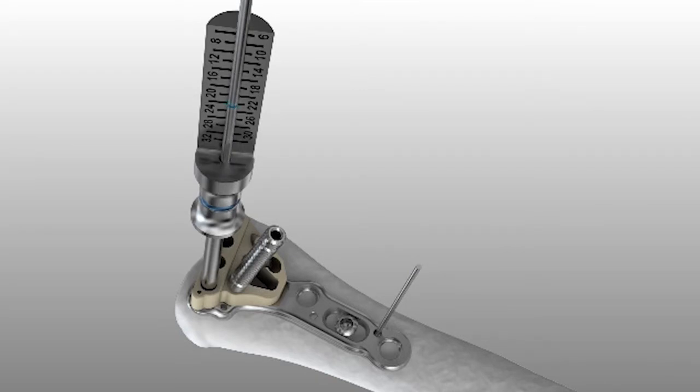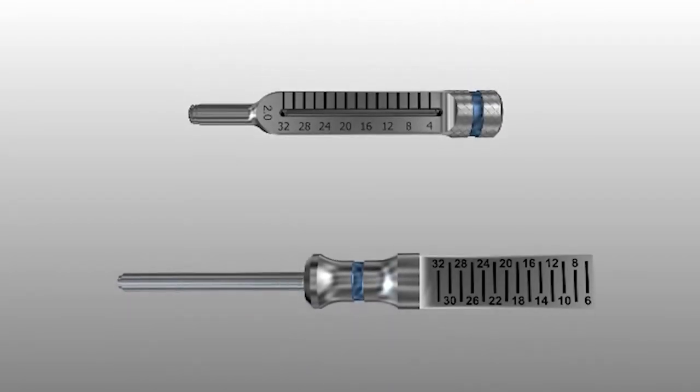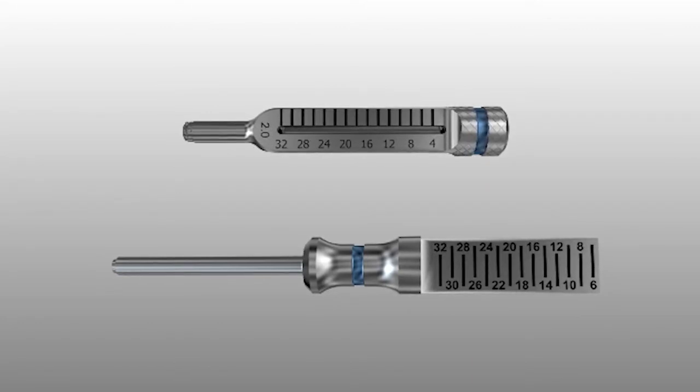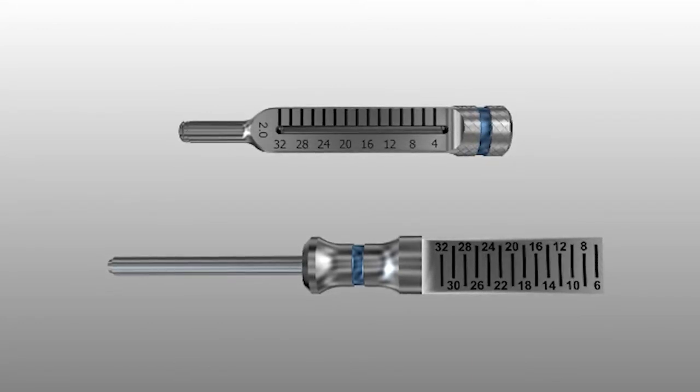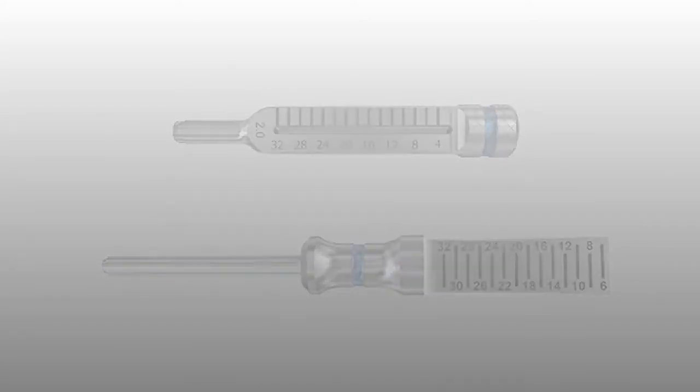Screw length is measured by using the laser mark on the drill or depth probe against the scale on the drill guide. Individual locking drill guides are also available in the system as an alternative for drilling and measuring the distal screw holes. Screw length can be read off of the laser line on the drill or probe with a locking drill guide as well.